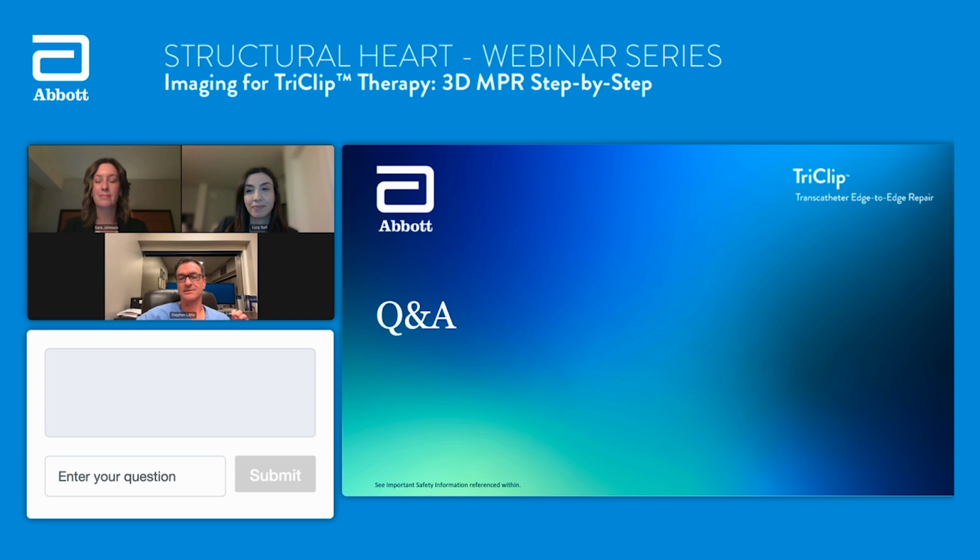The esophagus likes to move with the probe, and then even an MPR can degrade, because these are live MPRs. These aren't MPRs captured and looked at afterwards. It's live, and you have to recognize a little bit of maintenance, probe advancement or probe withdrawal or probe tension to maintain the image. It doesn't always stay there. If somebody has natural esophageal peristaltic motion, things can change. So it's incredibly useful. It does take a little bit of training and a little bit of practice, but I would say it's absolutely worth the effort.